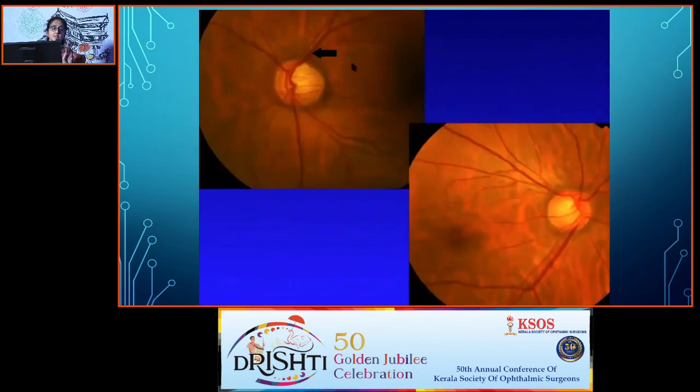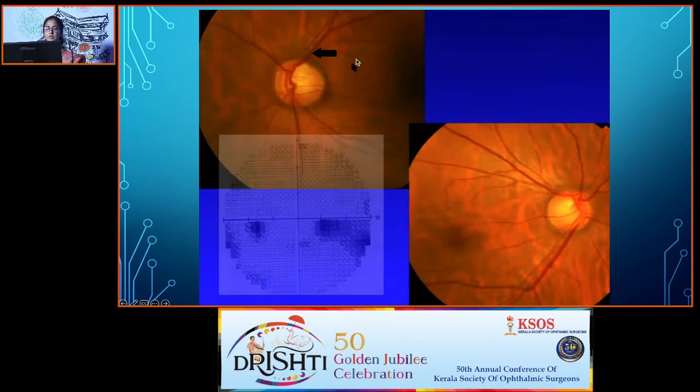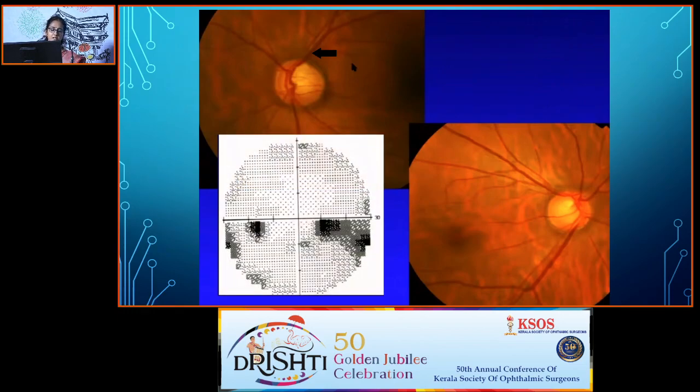Suppose it is a patient with a very tessellated fundus, it is even more difficult. But if you look carefully, you can see the superior notch here, and you can correlate it with the field. You can see the corresponding field defect inferiorly.